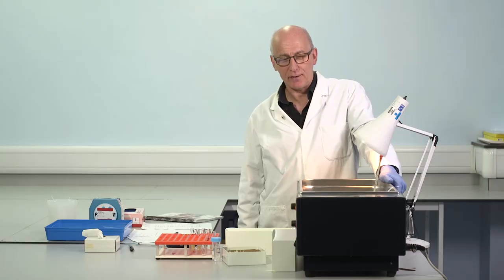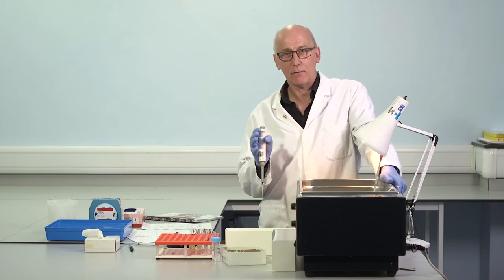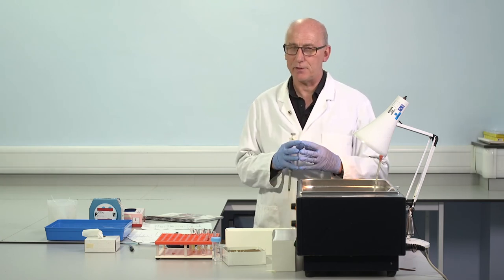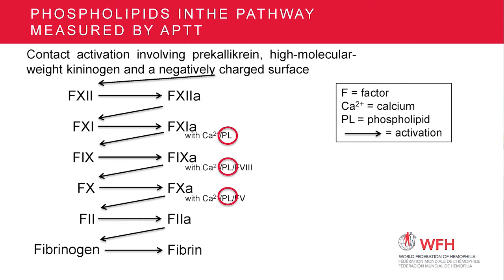Two really important components in the APTT reagent. We've talked about one already: the activator, silica, kaolin, ellagic acid. The other really, really important component is the phospholipids present in that reagent. What are they doing? They're taking the place of phospholipids in activated platelets or activated cell membranes in the patient. You know that when clotting occurs in the patient, the reactions are occurring on the surface of activated cells like platelets. Here we've got phospholipid present in the reagent to try and mimic that process, to substitute for the platelets in that process.